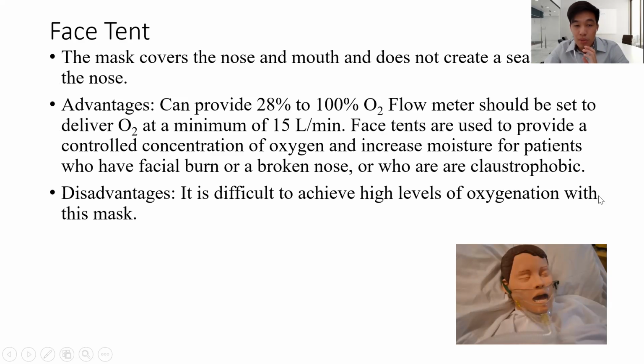The disadvantage is that it is sometimes difficult to achieve a high level of oxygenation with this mask.